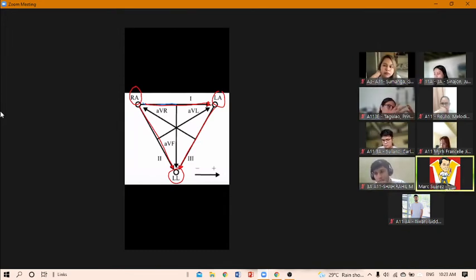So if you try to imagine the Einthoven's triangle and the heart, I will be drawing a representation of the heart with this blue color. It is a conical organ with a tapered apex and a wide base.